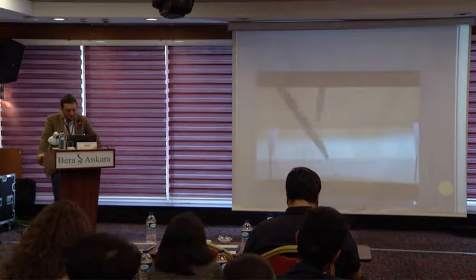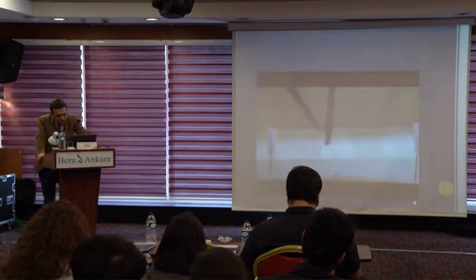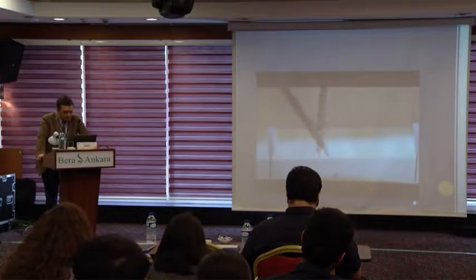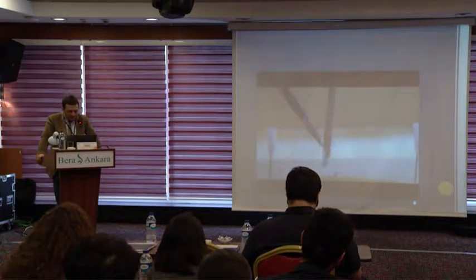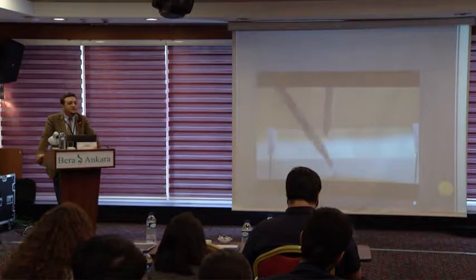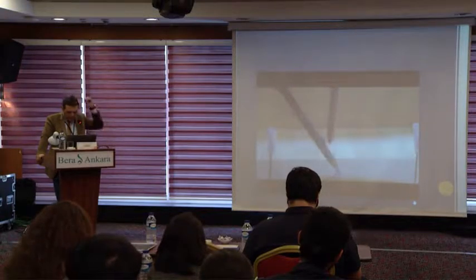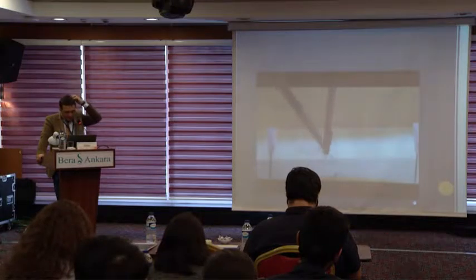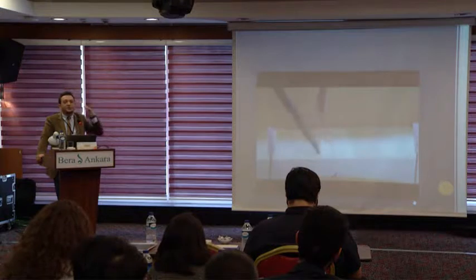All the basic box exercises are generally about object transfer, tissue dissection, working with scissors, knot tying, and endoscopic suturing on models. At the end, there are some videos of laparoscopic exercises.